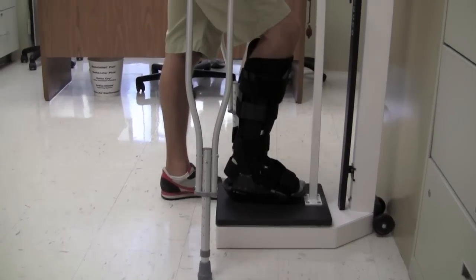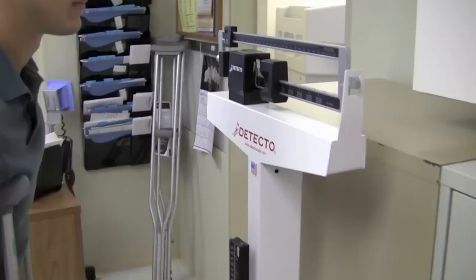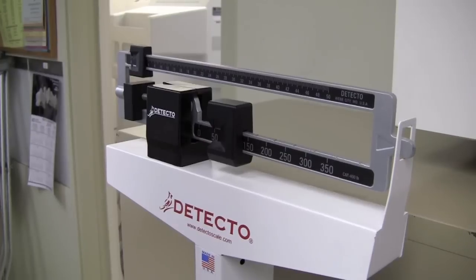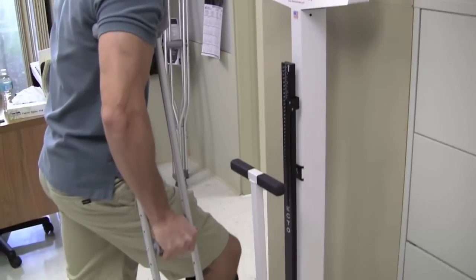We generally start at 40 pounds of pressure as partial weight bearing. Getting a sense of how much 40 pounds is is helpful by using the scale. The exact amount of weight is not critical or very important but is used as a guideline.